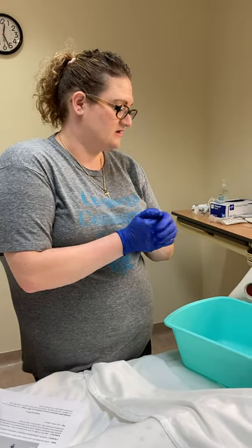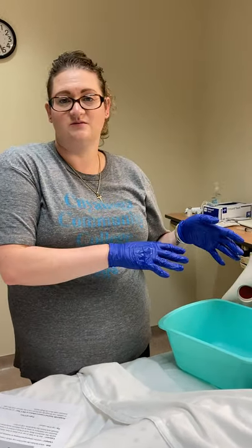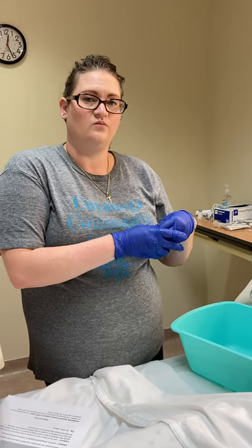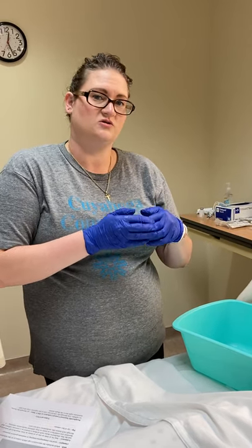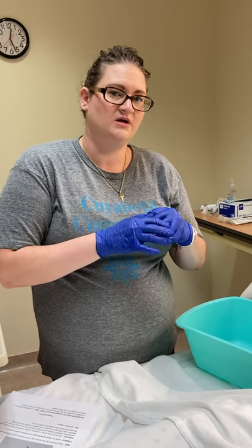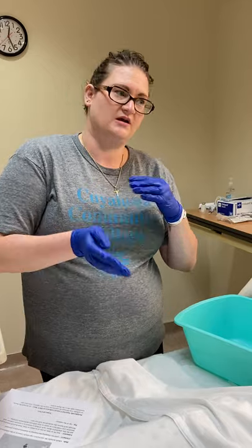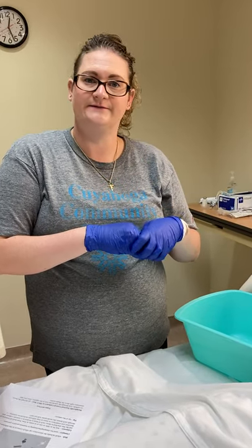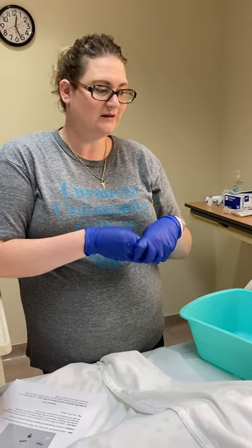That is it as far as medication administration through the central line. We will do a central line dressing change video and a central line blood draw video separately.